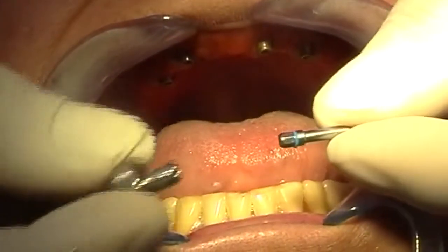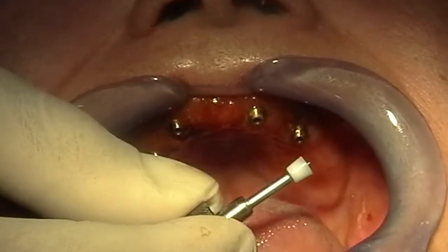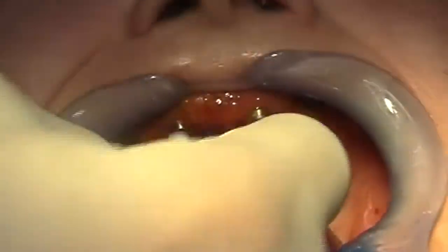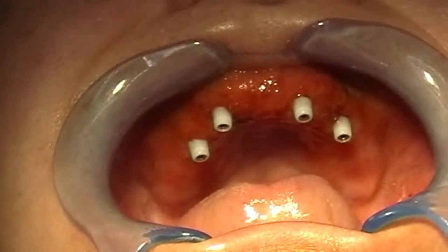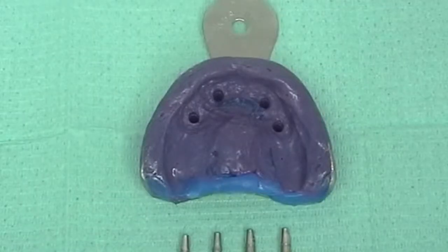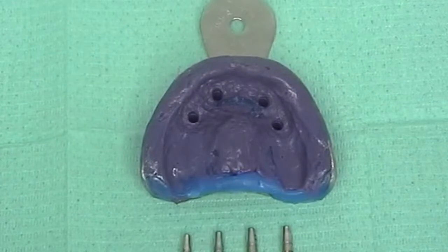I connect the specific adapter to the hand screwdriver and fix the caps with the standard connecting screw on the abutments. Now we have to relieve the provisional denture to create space for the abutments, and then we can send the patient home. The impressions and transfers are sent to the laboratory.